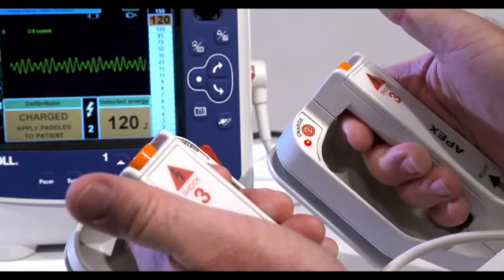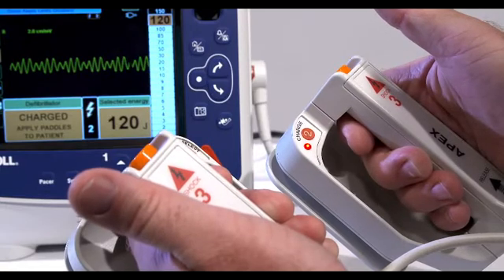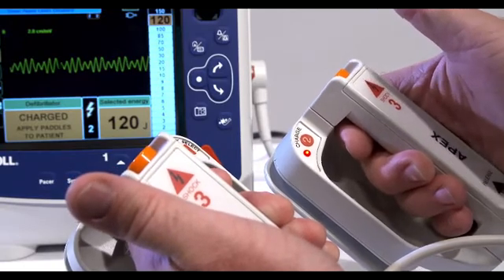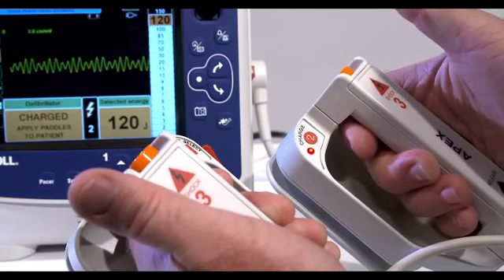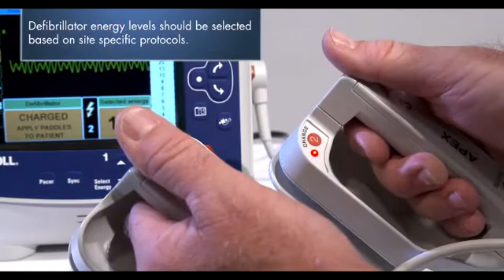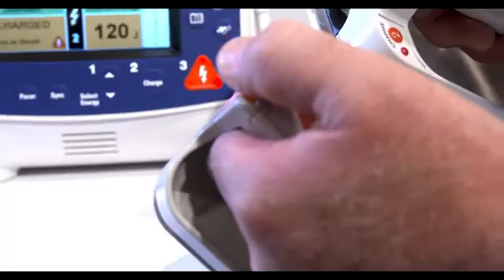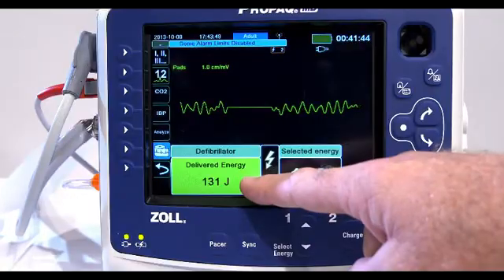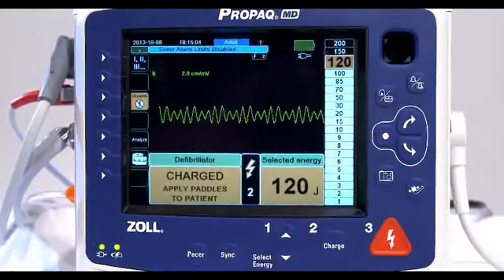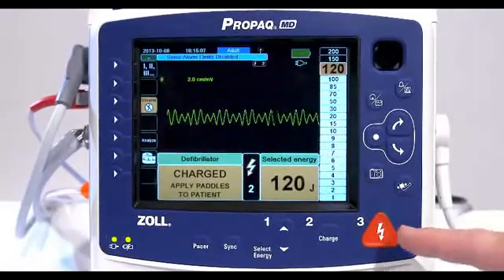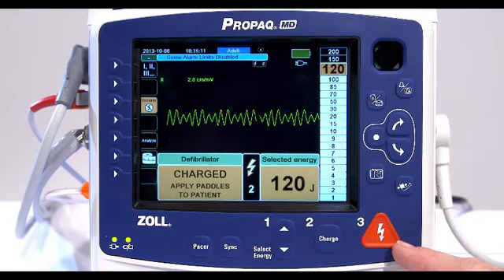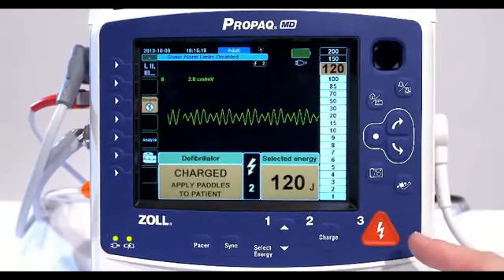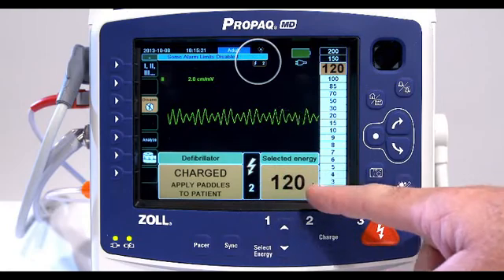The energy range bar graph on the right side of the display highlights the charge level until it reaches the selected energy. When the unit is fully charged, the tone changes to a continuous charge ready tone. The highlighted energy bar graph includes the selected energy and the charge indicator on the apex paddle lights up. Using your thumbs, simultaneously press and hold both shock buttons — one on each paddle — until energy is delivered to the patient. The front panel shock button is inactive when using external paddles.